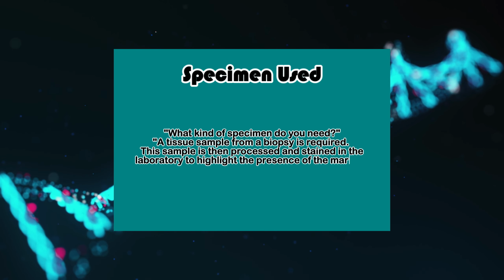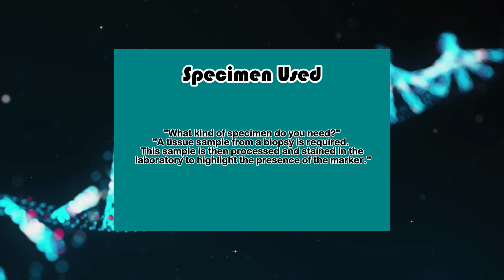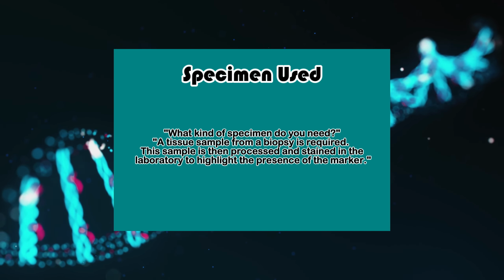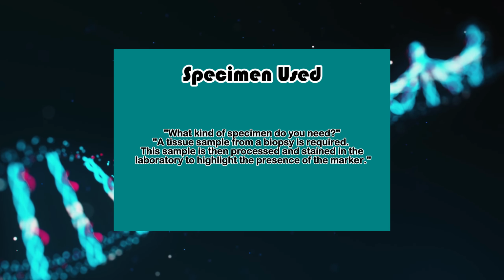Specimen used. What kind of specimen do you need? A tissue sample from a biopsy is required. This sample is then processed and stained in the laboratory to highlight the presence of the marker.